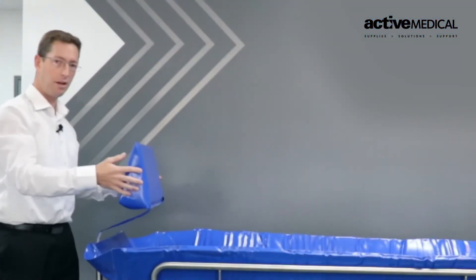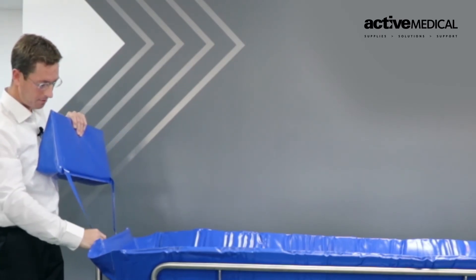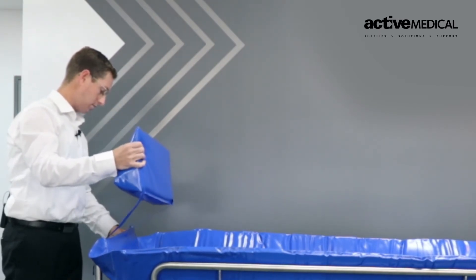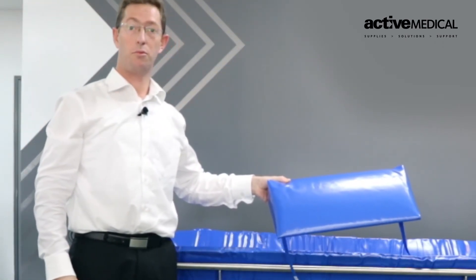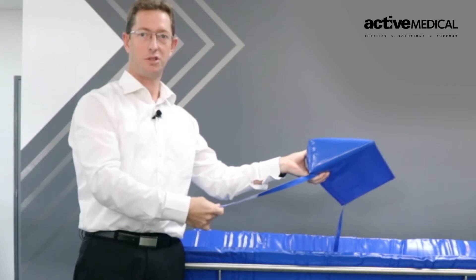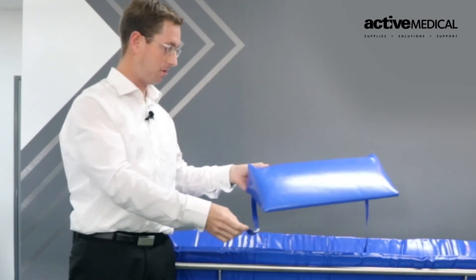We have a head pillow attached by two Velcro straps for the patient's comfort, which can be removed if not required. The length of the strap also allows it to be adjusted to the best position possible.